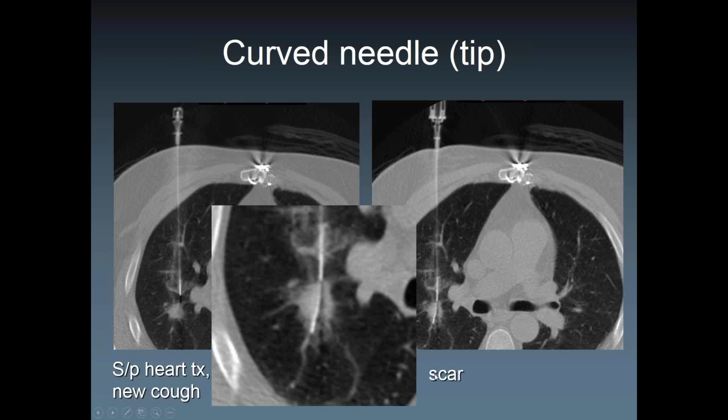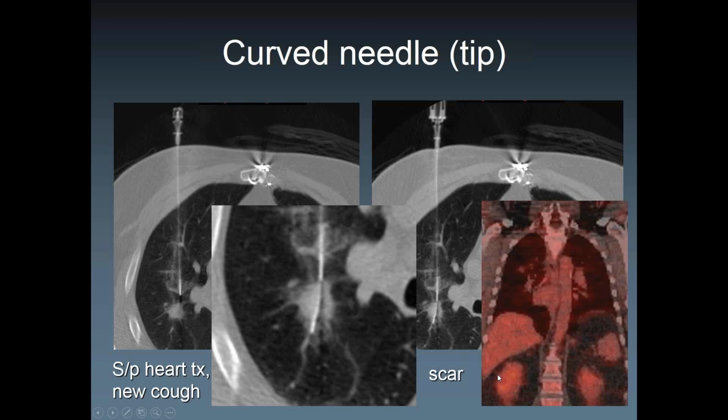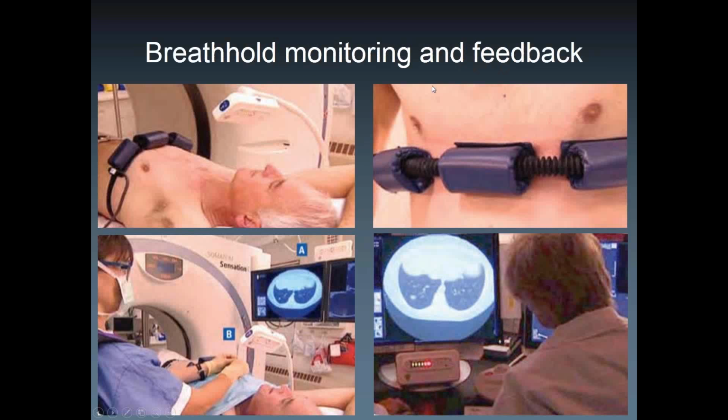And in this case, the target was just a scar. So even though it looks malignant, it may not always be malignant if it looks bad like that, right? And it ended up being also FDG non-avid on the follow-up PET like 6 months ago to make sure we didn't really get a false negative biopsy. So with negative biopsies, obviously you want to follow up on them one way or the other, right, to make sure the biopsy got representative tissue.